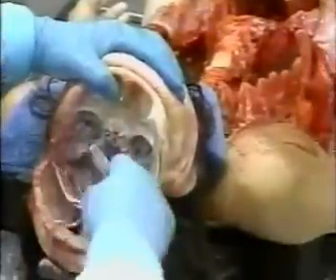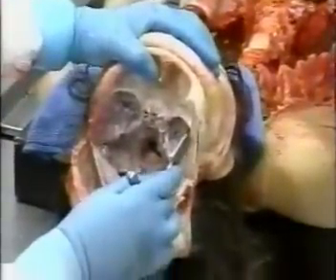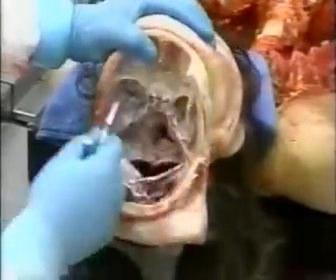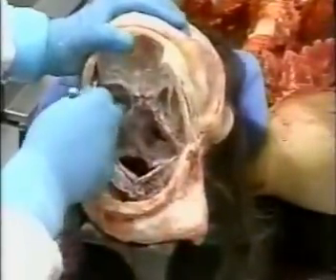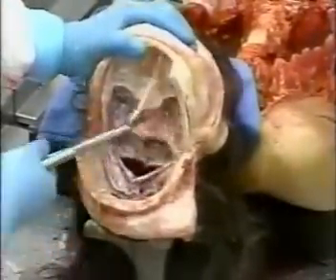The skull on the inside is lined by a tough membrane called the dura mater. In order for us to be able to visualize any fractures, that membrane needs to be peeled away from the underlying bone — and that's what the assistant is doing.